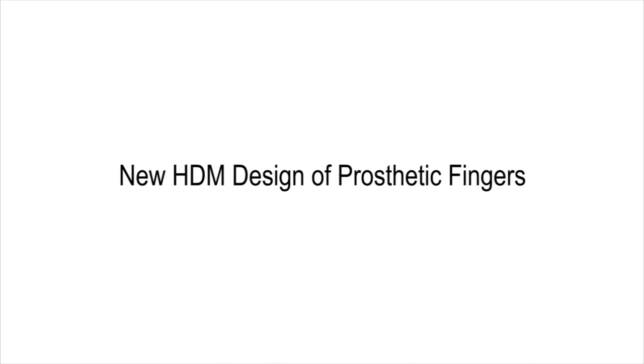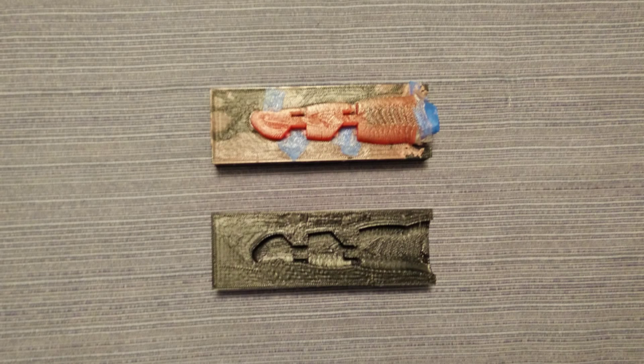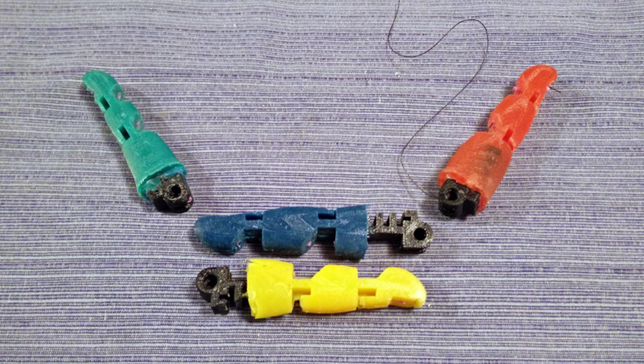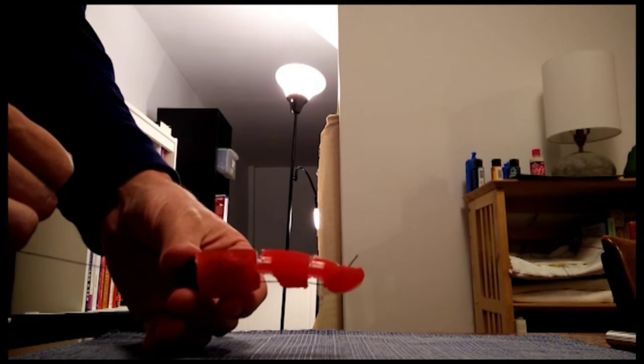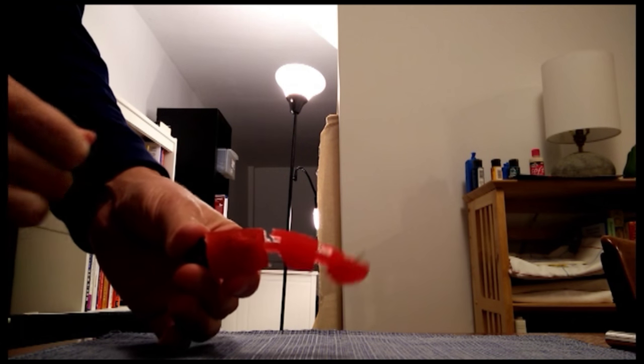In order to further automate the replication of our hand, enhance its modularity, aesthetically improve its look, and allow for the embedding of extra parts such as sensors, we developed a new design of prosthetic hand fingers based on fabrication with the method of hybrid deposition manufacturing, or HDM. All we need is a model of the human hand to create a mold, and the rest is handled by HDM. To demonstrate the advantage of this design, we implemented an NFC-ready version of this finger design concept.